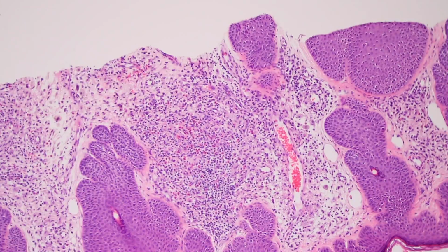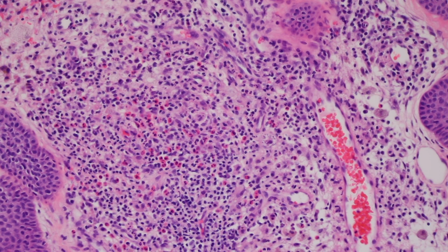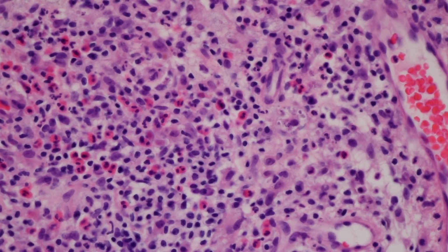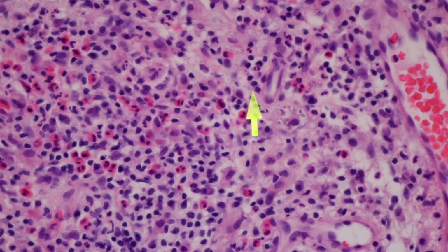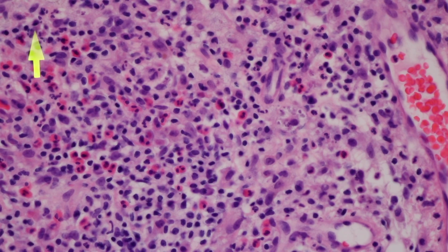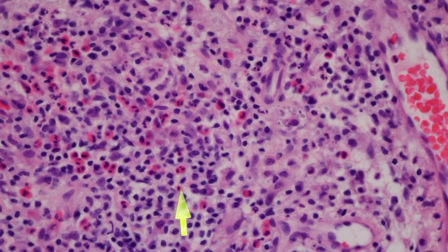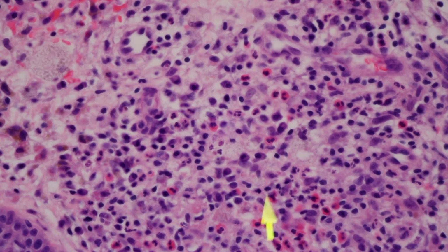And when you go down closer and look, what are these inflammatory cells filling the dermis? You see a variety of different cell types, which is also unusual. You can see here lots of eosinophils, histiocytes. So here's the histiocytes, these guys in here. There's the EOs with their little sunglasses, a little bilobed nuclei. And also look at these, neutrophils, scattered neutrophils. Not forming an abscess or anything, but just scattered in with these EOs and with these histiocytes and also some lymphocytes. And somewhere around here, there they are, plasma cells.